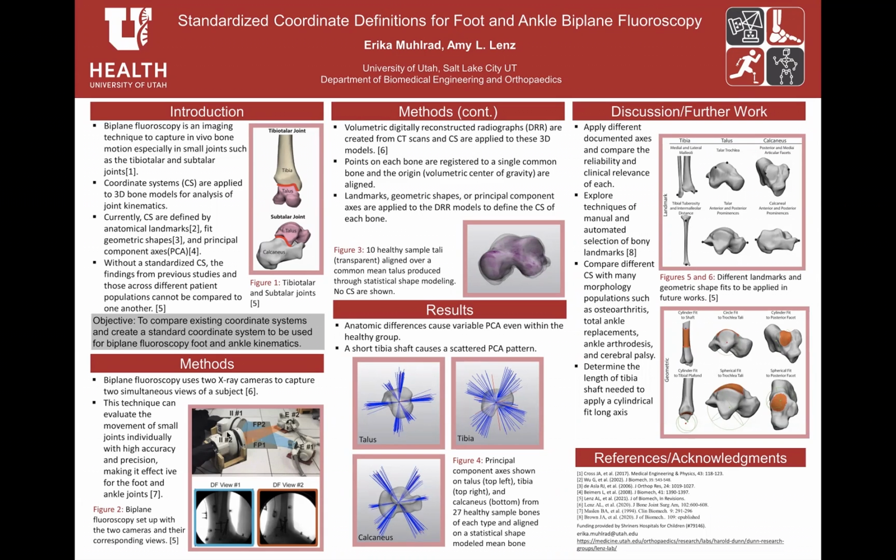The setup for biplane fluoro is shown in figure 2. A separate CT scan is made into a 3D computer model of each of the bones in the foot, called a digitally reconstructed radiograph, or DRR. By lining up the 3D bone models to the two views of the X-ray from the biplane fluoro, we're able to precisely calculate and quantify motion of each of the small bones in the foot and ankle. The precision with biplane fluoro is something that's not possible with skin-based motion capture techniques.